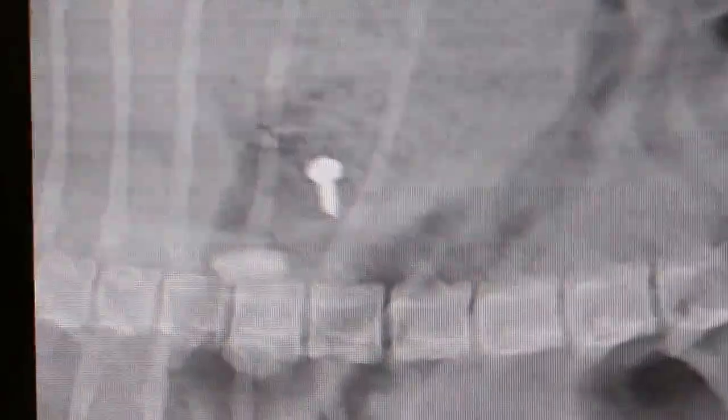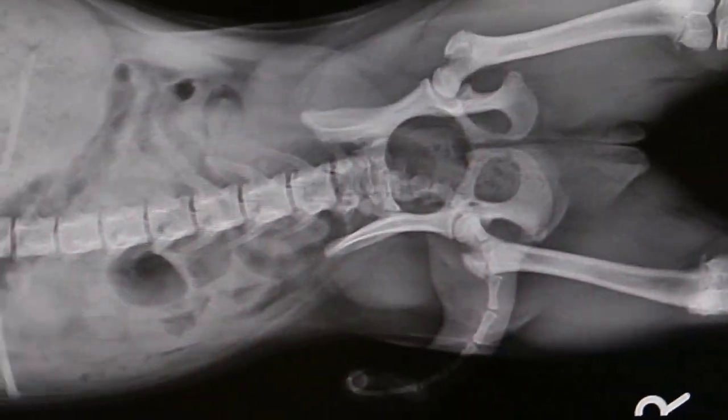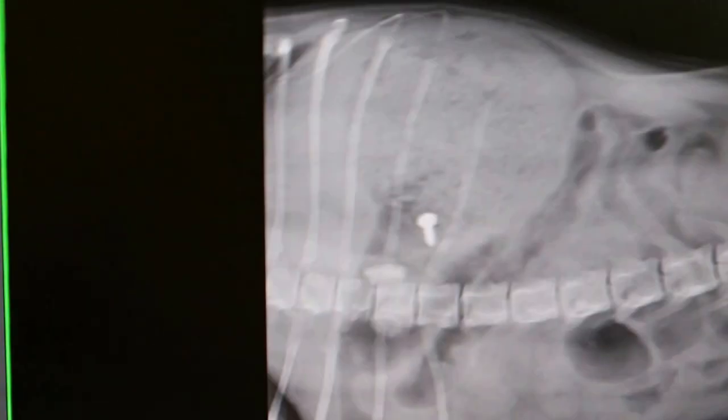The X-ray is okay. I can see the screw is inside the stomach, so we don't need to look further. The intestines are okay. This could also cause gastroenteritis. Okay, can go already.